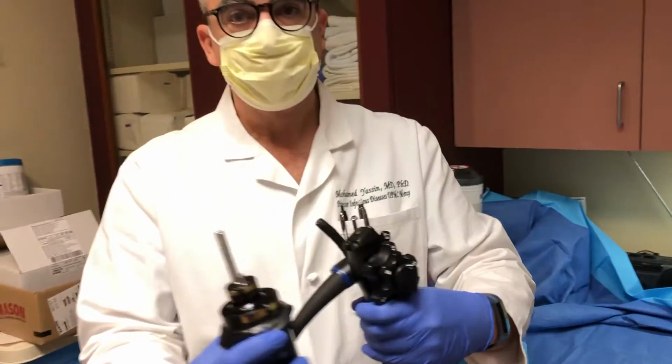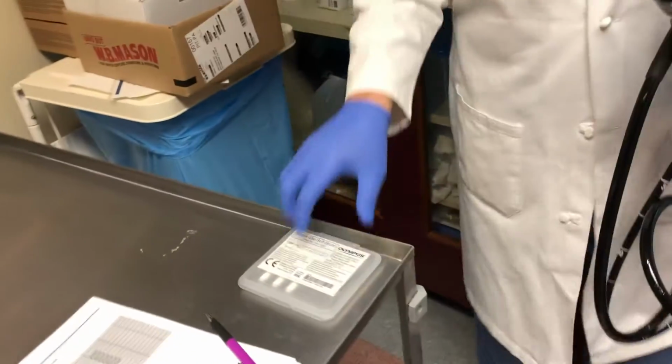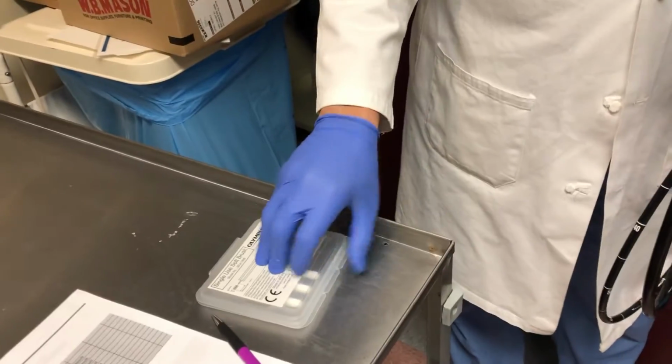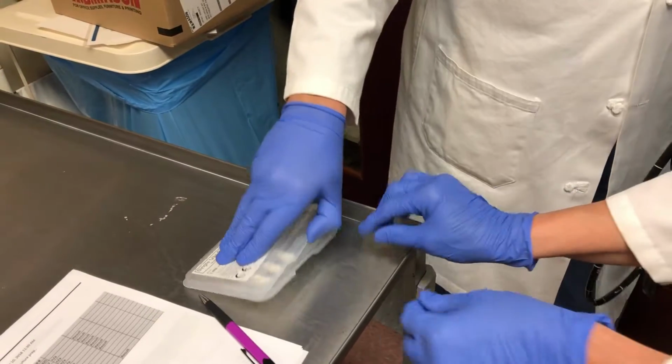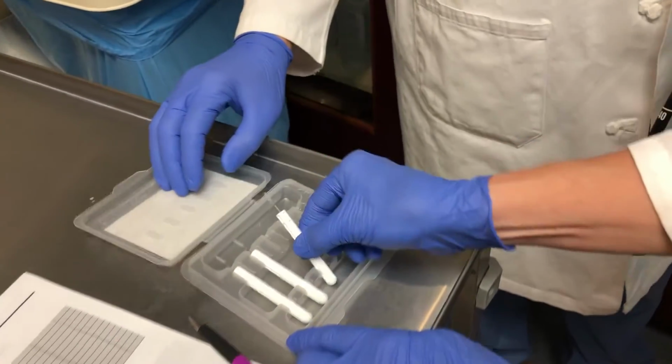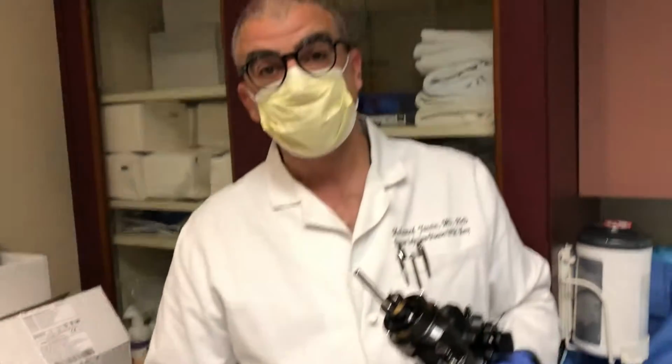Okay. And Dr. Yassine, do you want to talk about these other brushes that you have here? Yeah, these smaller brushes are used specifically to brush the elevator channel for some of the ERCP scopes in the US. You can see it's a finer, smaller brush, and we typically use it for brushing above the elevator channel where it's hard.